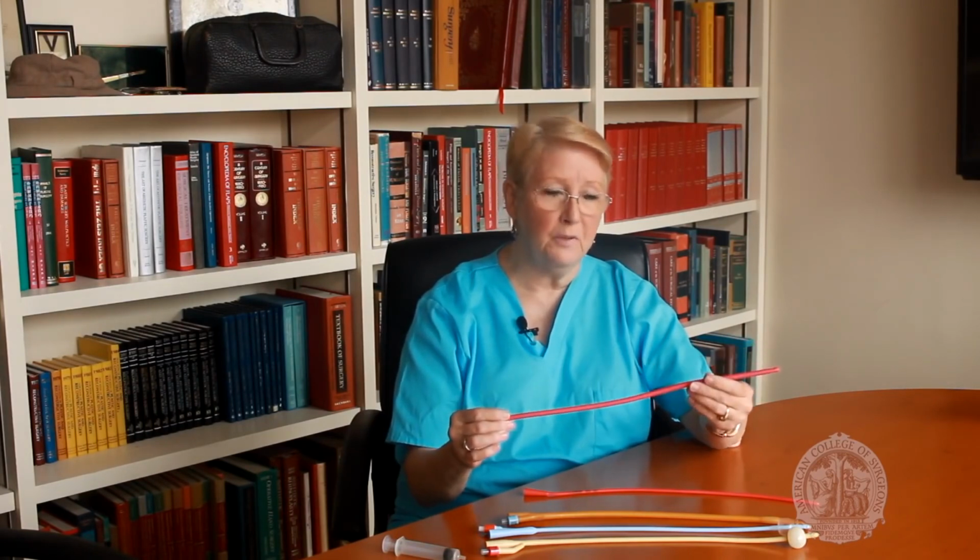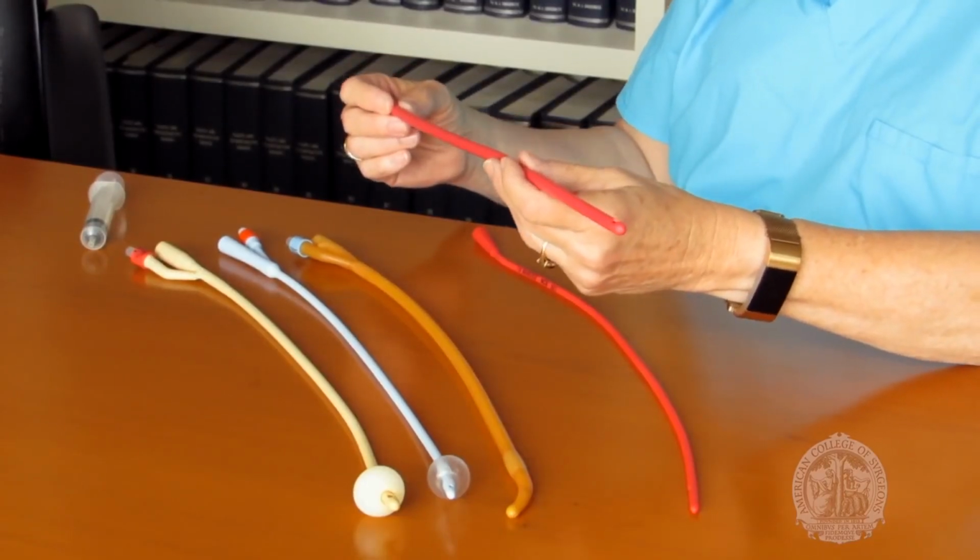The other type of catheter is a non-indwelling or straight catheter. These are used when the patient only has to be catheterized once. They are still placed under sterile technique, but they don't stay in the body after the bladder is drained. They are not connected to a collection system, but instead drain directly into a basin. Many people self-catheterize at home using a straight catheter.